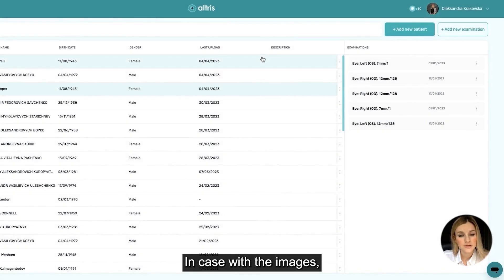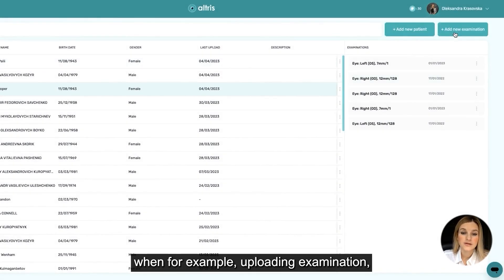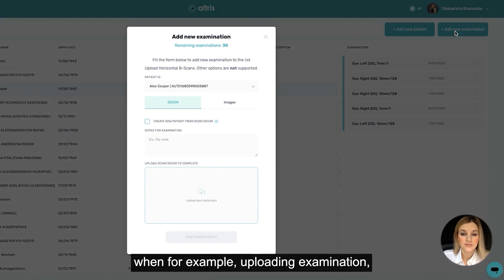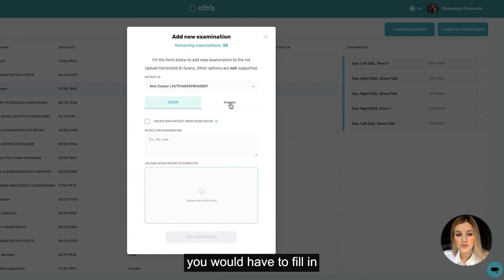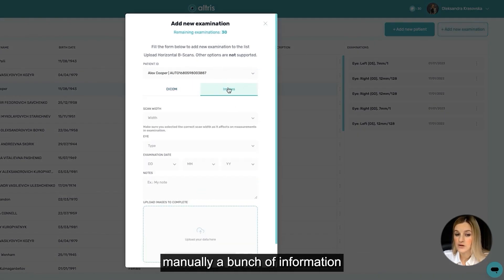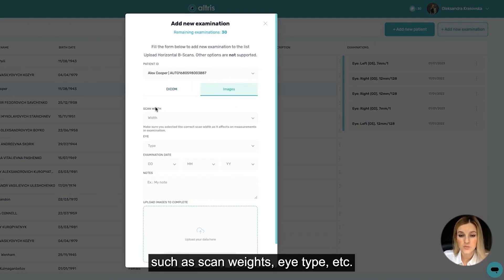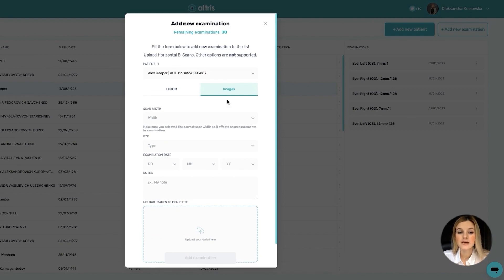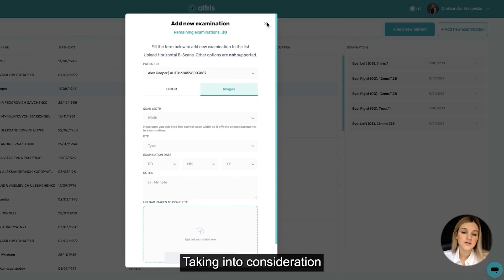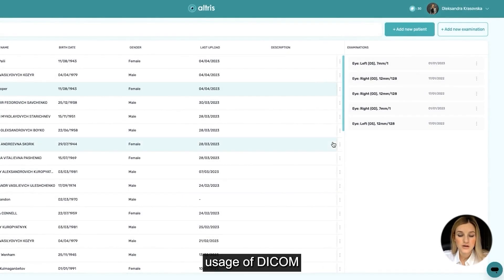In the case of images, when for example uploading an examination, you would have to fill in manually a bunch of information such as scan width, eye type, etc.